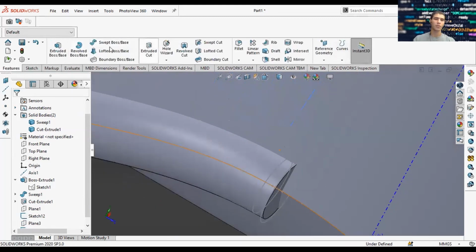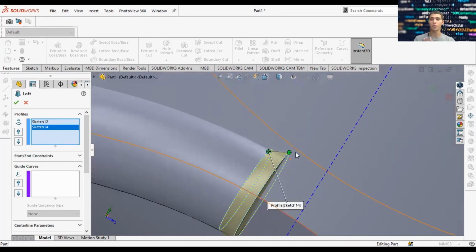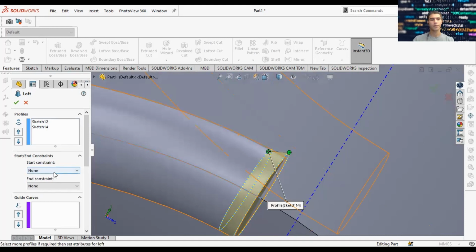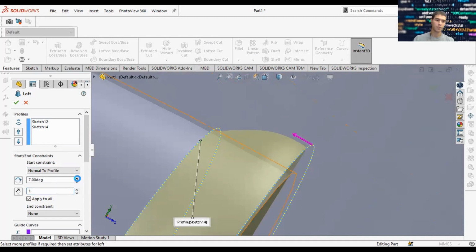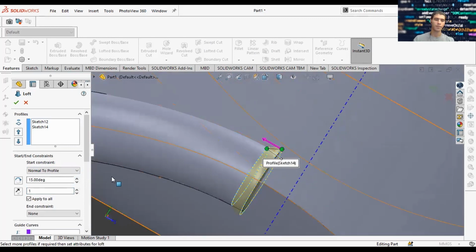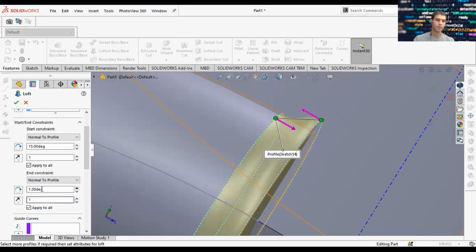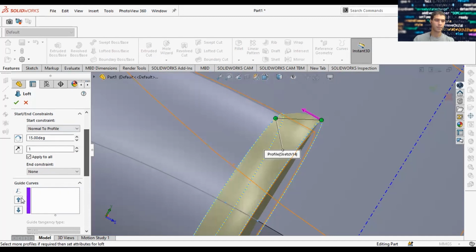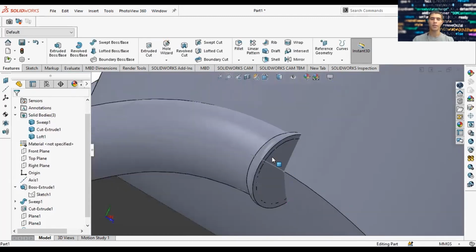So let me introduce you to a new feature that you can use called the loft. And the loft is going to make a continuous connection between two sketch profiles. And so we selected our two circles as our sketch profiles for the loft, and we're going to set some constraints so we can round the shape of the loft. That's good. And so once you're satisfied with the loft, you click OK, and it should create these kind of fillet-looking parts.